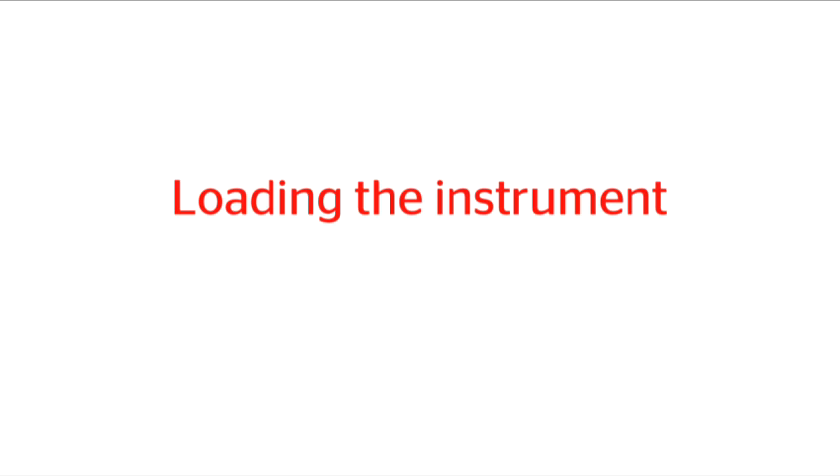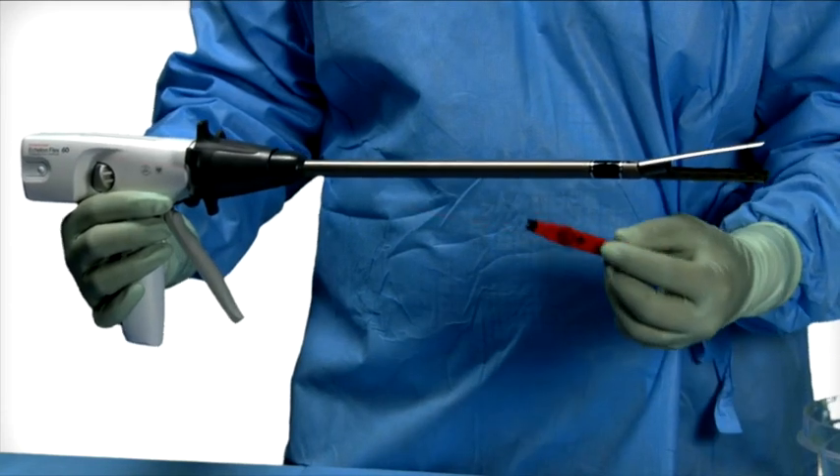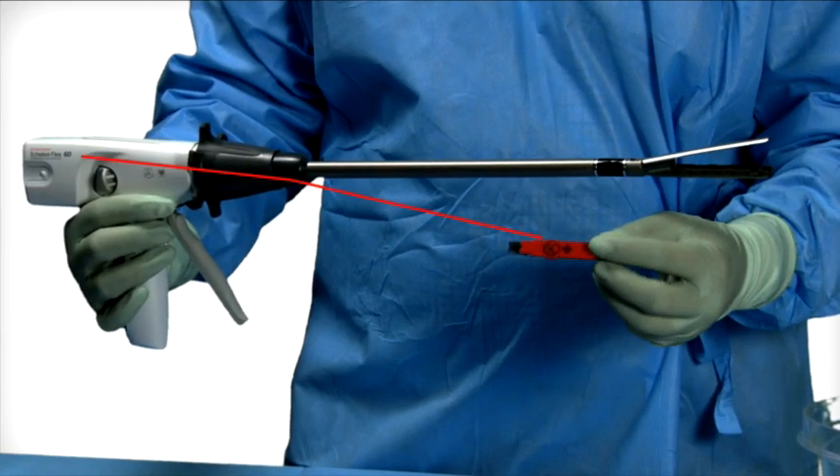Loading the Instrument. Tissue thickness should be carefully evaluated prior to using the instrument. Refer to the Reload Product Codes Chart for proper reload selection. Verify the reload size matches the instrument size.